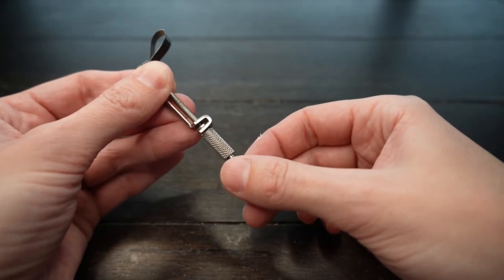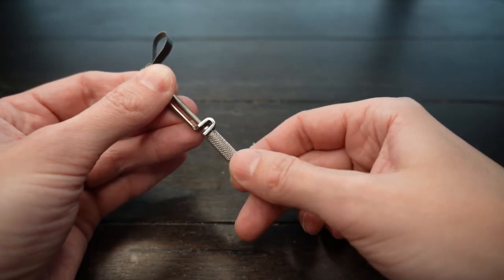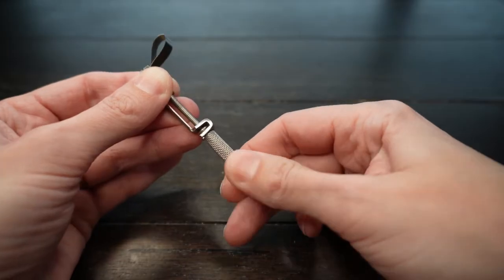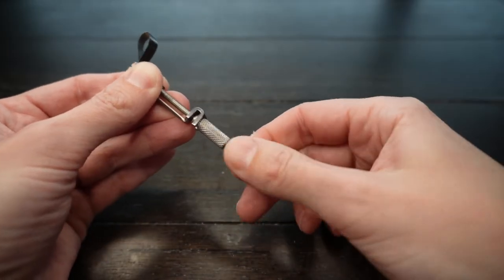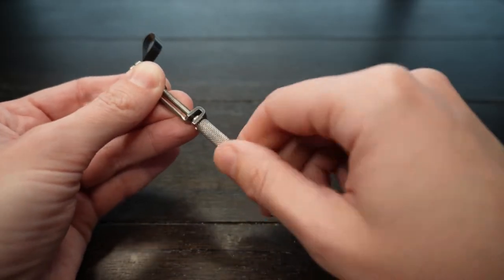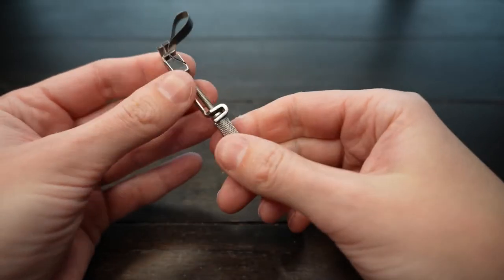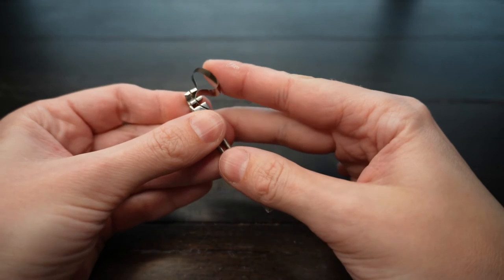Then you need to secure the screw. This is the main screw, it secures the band in the Tofflemire. So I would screw it pretty tight when you turn clockwise. It secures it. Once you're done, you need to adjust the size of your band.